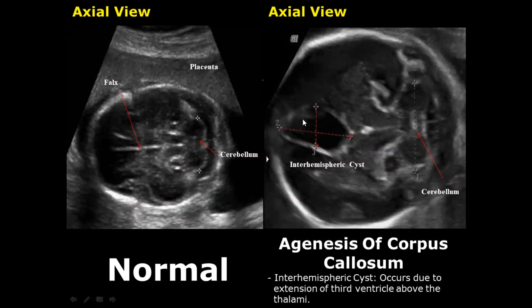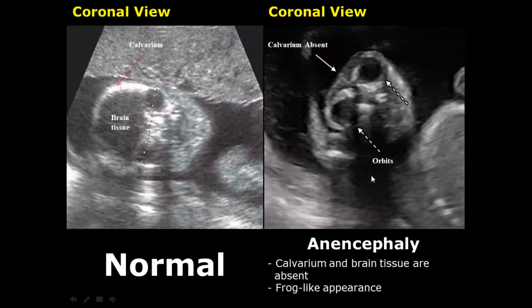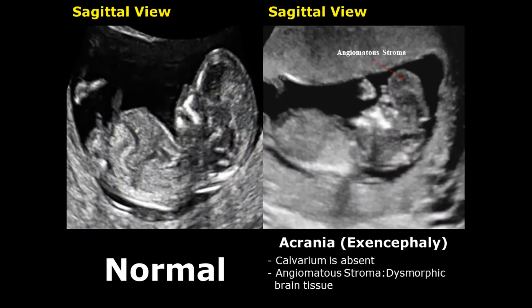An interhemispheric cyst is present between the cerebral hemispheres in the midline, occurring due to extension of the third ventricle above the level of the thalami. Anencephaly is a condition in which both the calvarium and brain tissue are absent — the calvarium is the part of the skull surrounding the brain. Exencephaly, or acrania, is a condition in which the calvarium is absent but abnormal brain tissue — called angiomatous stroma — is present.